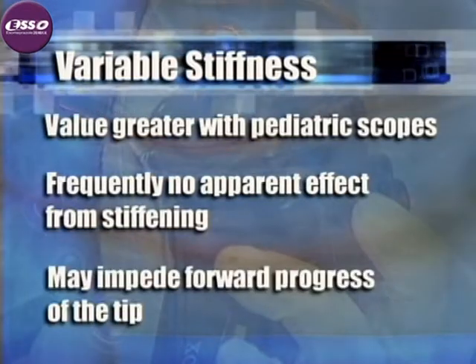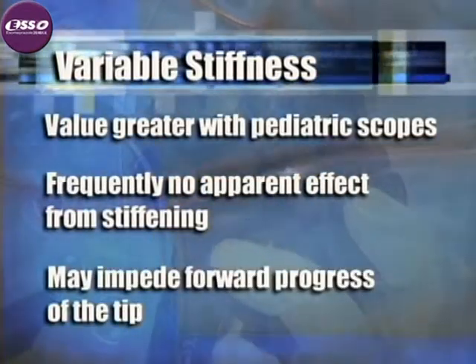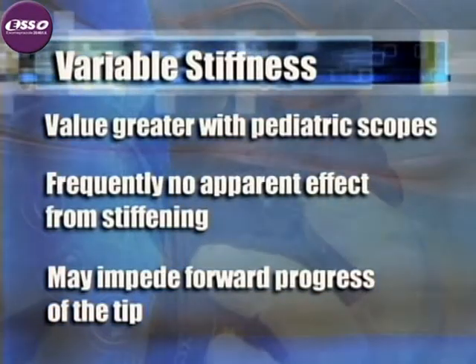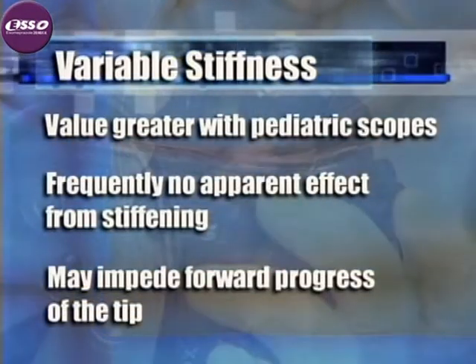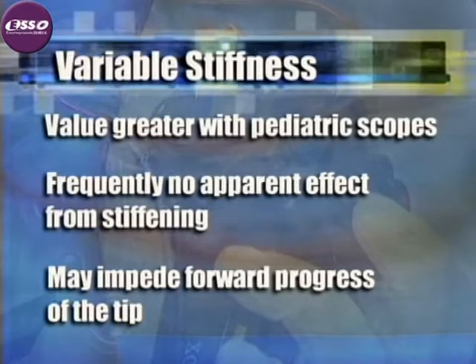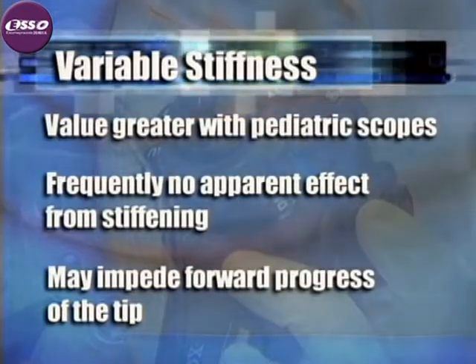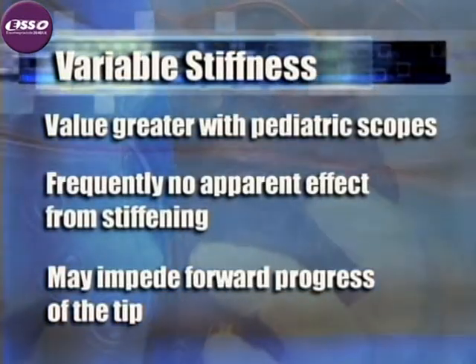Third, I'm convinced that there are specific instances in which activation of the stiffener actually impedes advancement of the colonoscope tip. Therefore, if you have activated it to help pass an area of difficulty, and now you encounter another area of difficulty later in the examination and the stiffener is still activated, remember to try to deactivate the stiffener and place the colonoscope in the more flexible mode again.